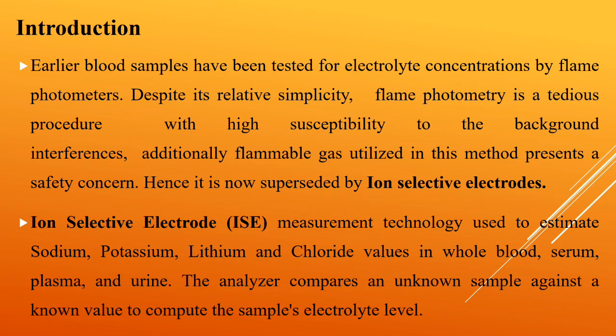Ion-selective electrode measurement technology is used to estimate sodium, potassium, lithium and chloride values in whole blood, serum, plasma and urine. The analyzer compares an unknown sample against a known value to compute the sample electrolyte level.